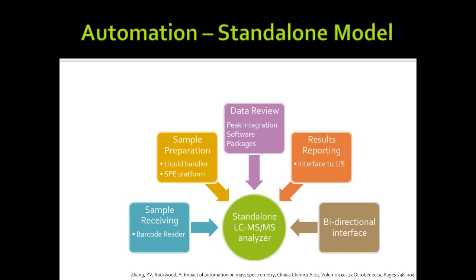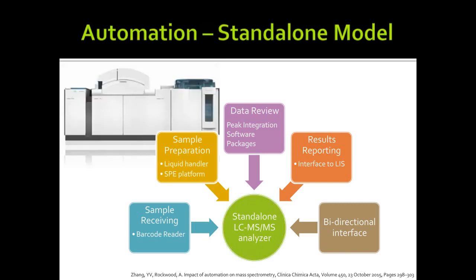And I put the bidirectional interface separate, as this is a very important element to make this more automated than what we have now. The interface will save a lot of time. No preaching for any vendor, this is one of the Roche analyzers, just like a standalone cobas. This is what we use, so that's what I'm familiar with.